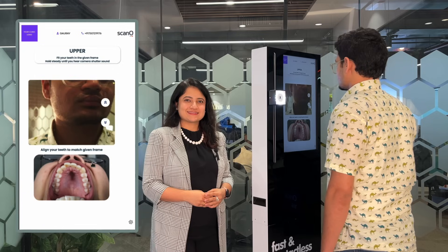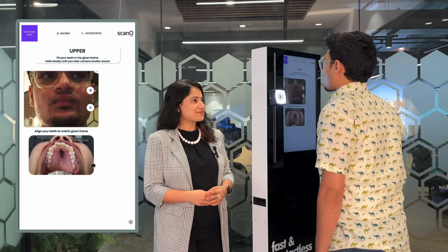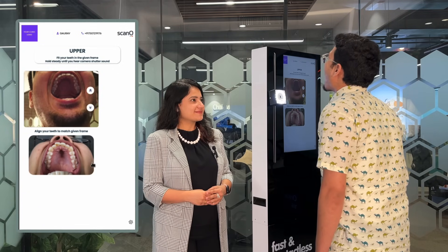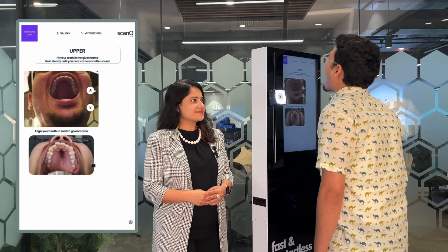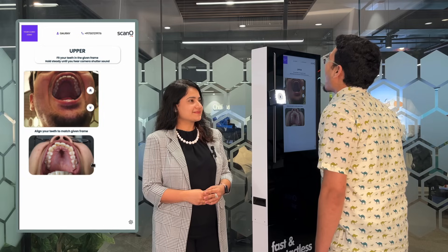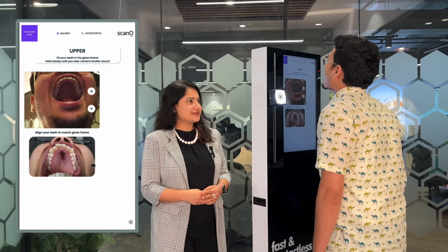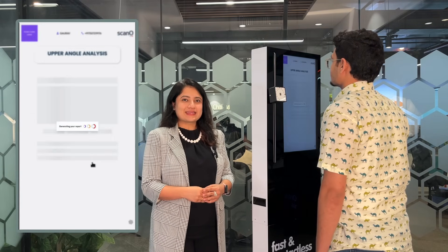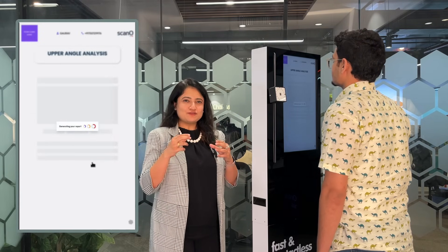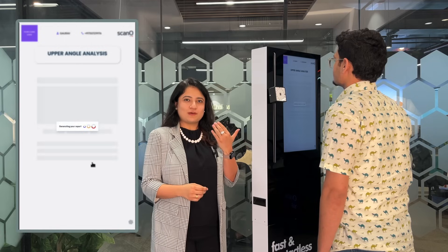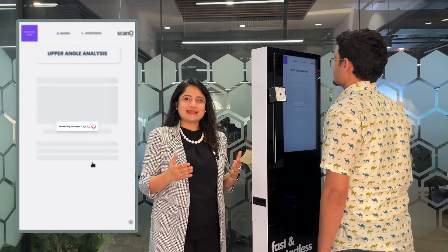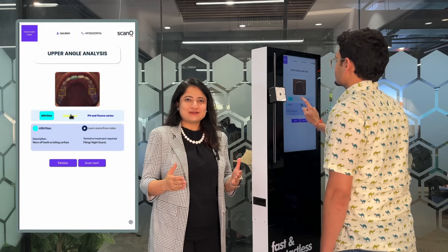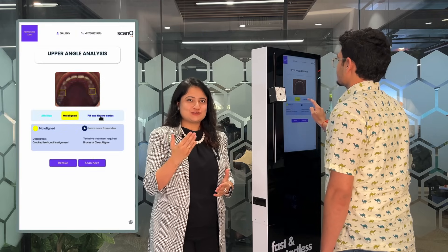Open your mouth like in the picture and tilt your head towards the ceiling. Don't move. For the upper angle, our camera swiftly tilts towards the roof of the mouth so that it can capture all the teeth, right from incisors to molars.